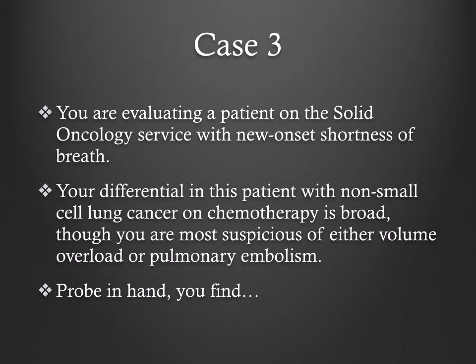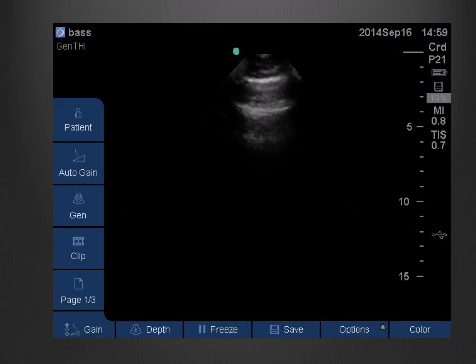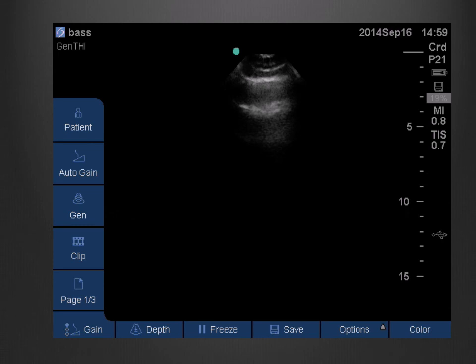Finally, Case 3. You are evaluating a patient on the solid oncology service with new onset shortness of breath. Your differential in this patient with non-small cell lung cancer and chemotherapy is broad, though you are most suspicious of either volume overload or pulmonary embolism. Probe in hand, you find this patient has diffuse A-lines without evidence of B-lines and also exhibits positive lung sliding throughout, rendering alternate diagnoses including pneumonia, pneumothorax, and pulmonary edema less likely. Your pretest probability for pulmonary embolism increases, and you send your patient to CT scan.